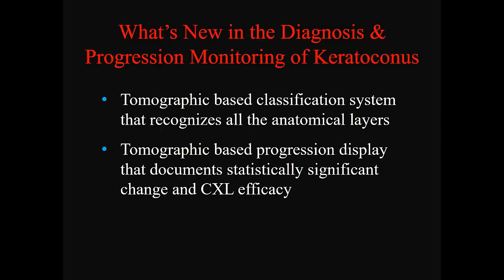So what's new in the diagnosis and progression monitoring? Again, a tomographic-based classification system that recognizes all the anatomical layers, a tomographic-based progression display that documents statistically significant change and also allows you to document cross-linking efficacy.